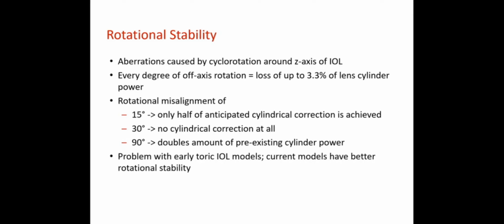I think the best way is to ask the person that has done the measurement to see whether they have included posterior cornea. The terminology they use in the IOL Master 700 is TK, total keratometry. I've not seen the 700 printout, but what I know is that the terminology they use for the combined posterior and anterior measurement is total keratometry reading.